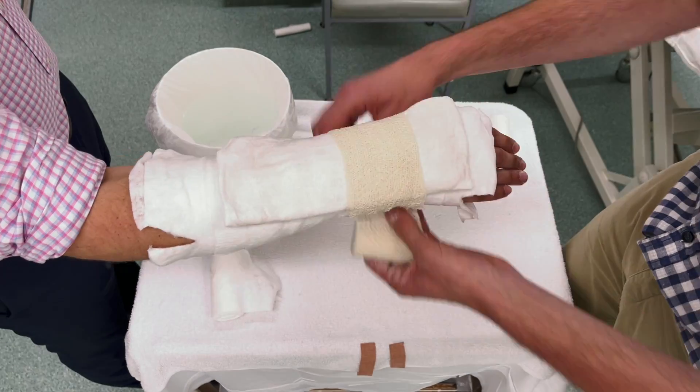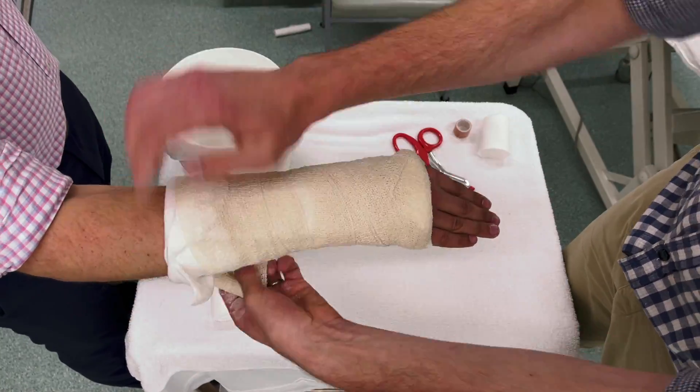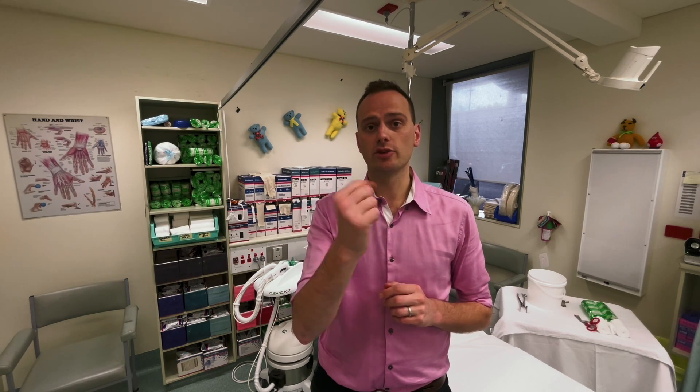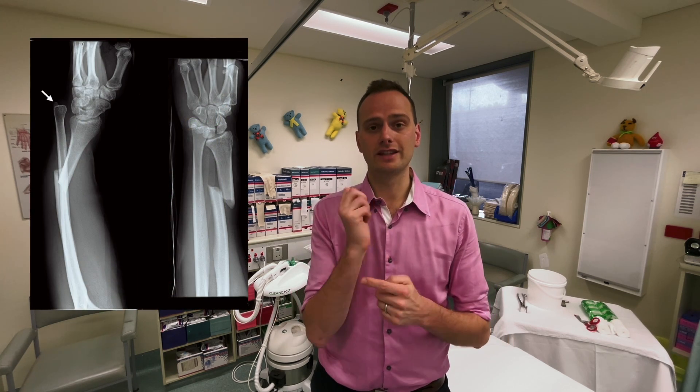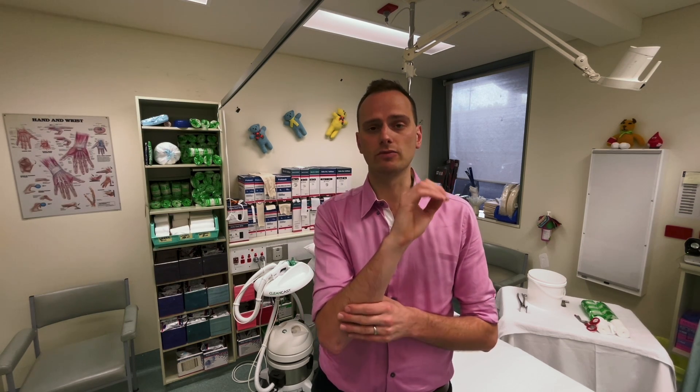Further down towards the wrist, the most common things in emergency departments are backslabs and below-elbow cylinder casts or full casts. If you have a break of both the radius and ulna, give thought to whether it's worth stopping pronation and supination by using an above-elbow cast — particularly if there's been a dislocation of the distal radioulnar joint, complex fractures, or more proximal fractures. In patients with small arms it may be difficult to control a fracture with a below-elbow cast only.